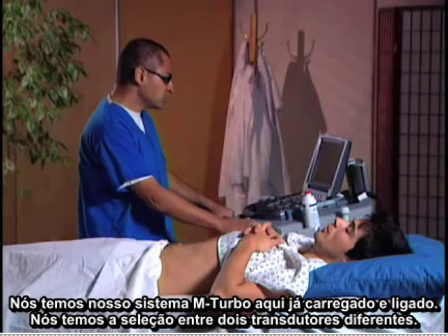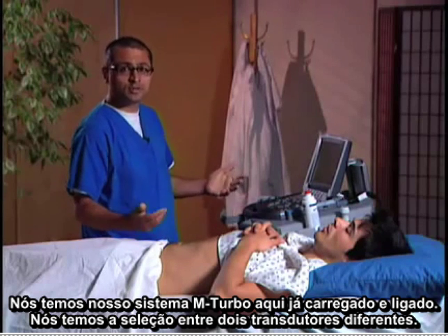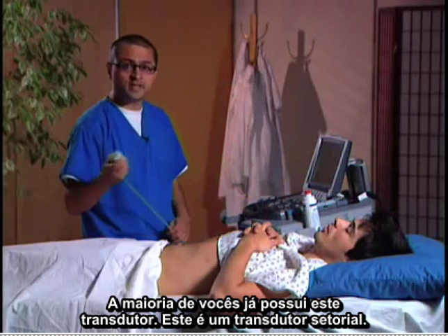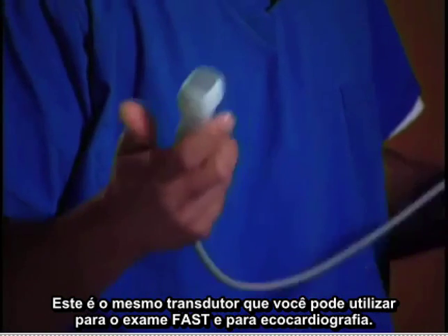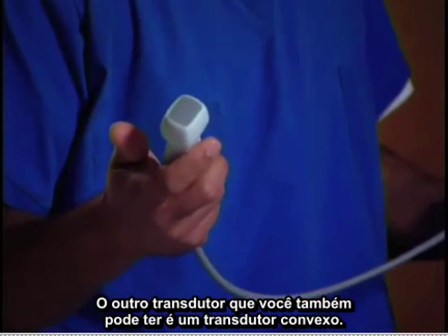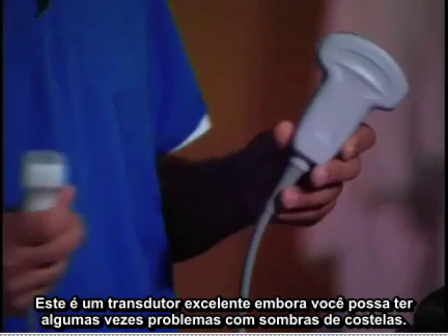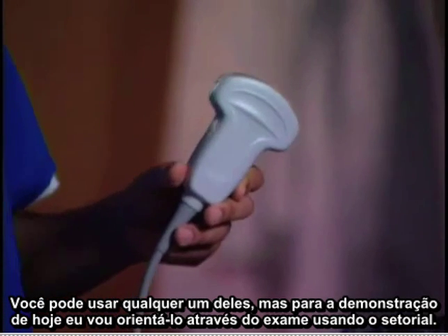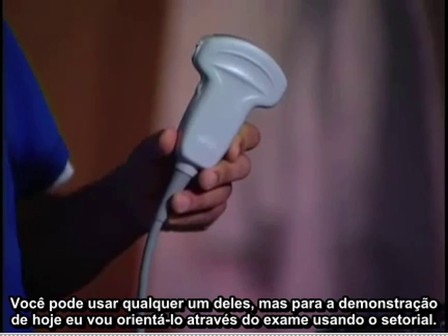We have our M-Turbo system here. It's already powered up and on. We have a selection of two different transducers. Most of you may already have this transducer. This is a phased array transducer. This is the same transducer you're going to use for the FAST exam and for echocardiography. The other transducer that you may also have is a curvilinear transducer. This is an excellent transducer, though you'll sometimes have problems with rib shadows. So you can use either one, but for today's demonstration, I'm going to take you through a phased array.